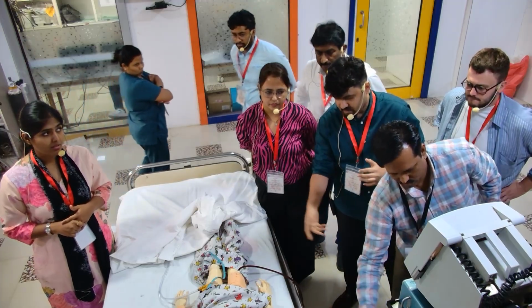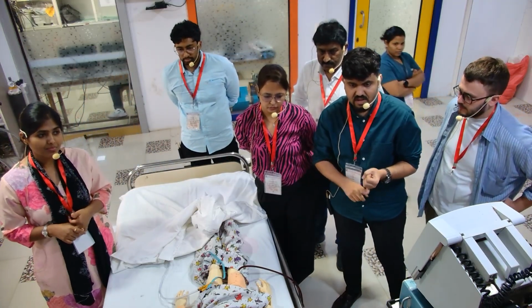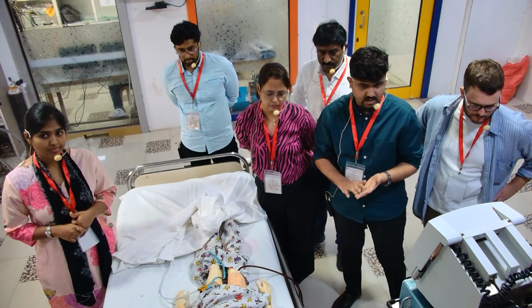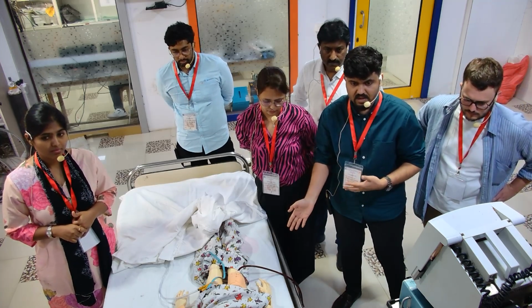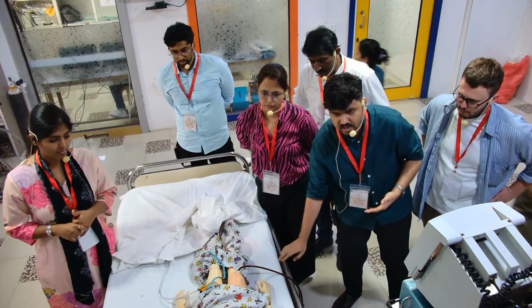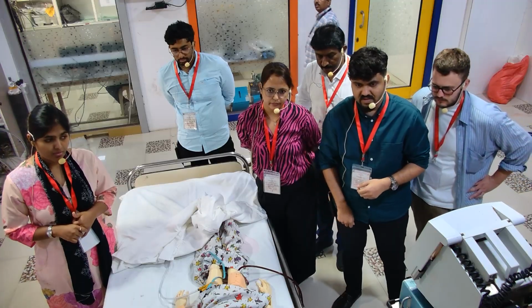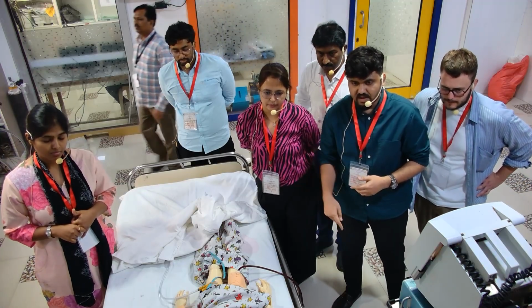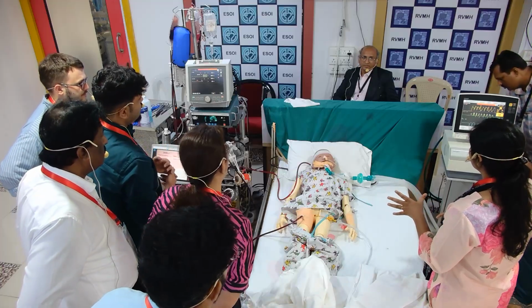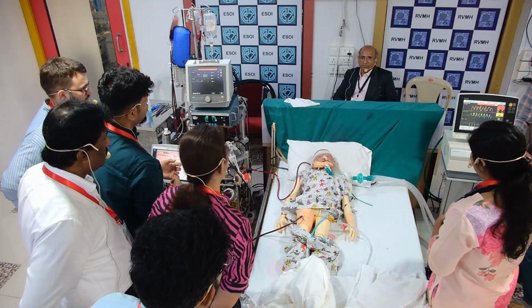Then we noticed that usually there should be a mechanical obstruction. So we started with fluid resuscitation. After fluid resuscitation, even then the flow did not increase. So then we looked at the mechanical problems like kinking. We noticed that there was a definite kinking. The bedside railings had actually kinked the drainage cannula tube. So the drainage cannula was the issue. And it was very sudden, not a gradual one. The flow change was sudden. Initially there was hypotension, hypoxia.